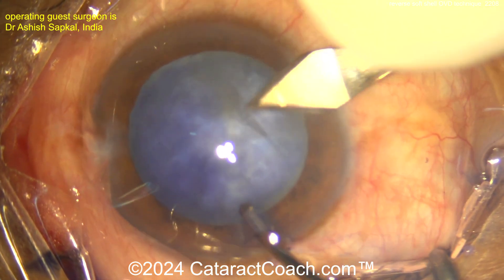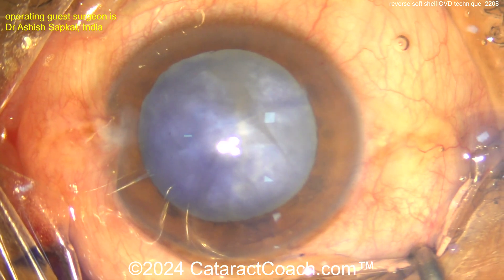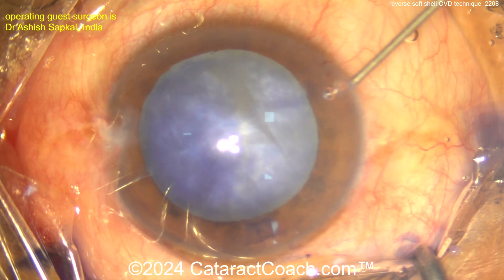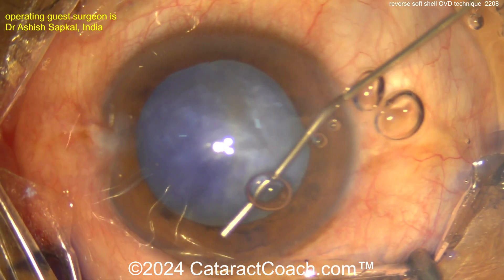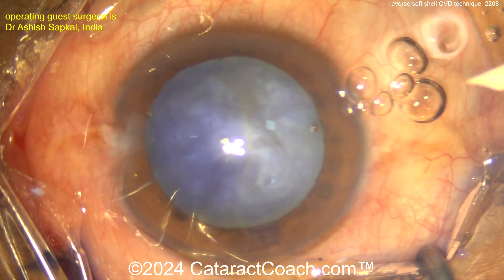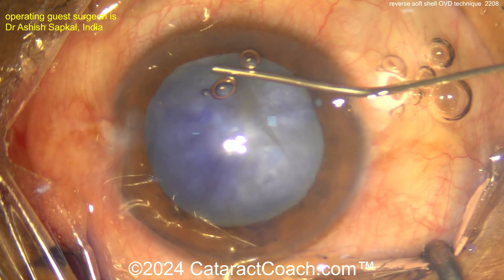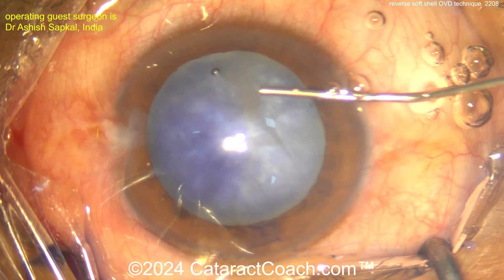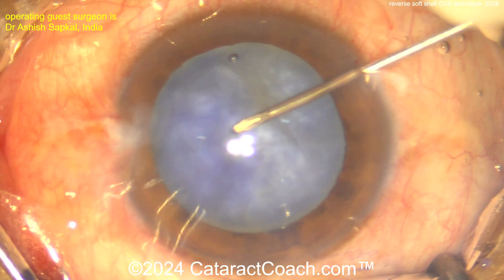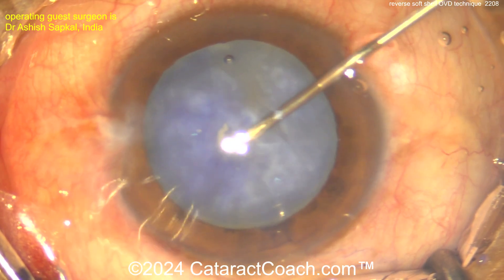The surgeon is going to use what he calls a reverse soft shell technique. In the center, a little dispersive viscoelastic, and now in the periphery a cohesive viscoelastic to really push down on the peripheral part of the lens capsule — 360 degrees of cohesive viscoelastic pushing down on the peripheral lens capsule, with dispersive agent in the center. Now poking with the cystotome.